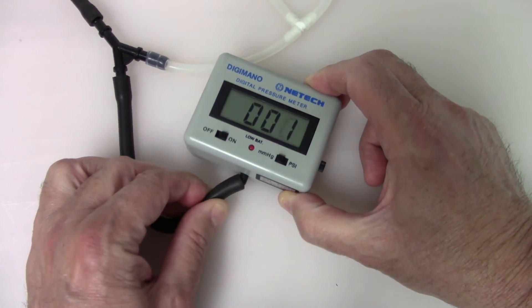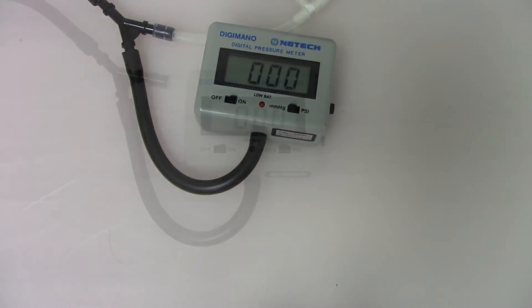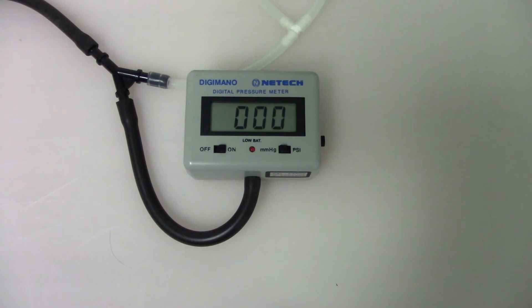Before inflation, the reading on the manometer should be zero. If not, open the valve of the squeeze bulb to let the whole airway open to atmosphere. Close the valve after the reading turns to zero.